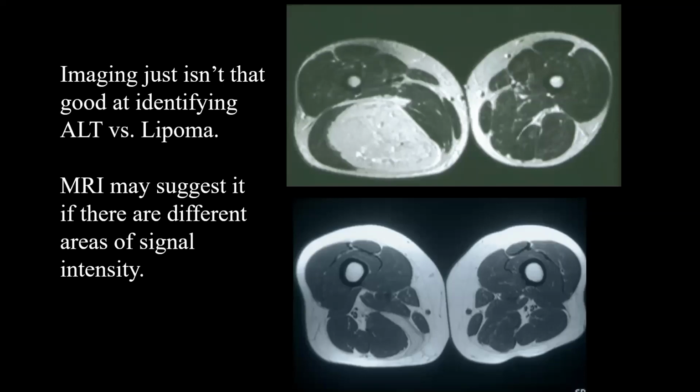Now, let's talk a little bit about the clinical imaging on this, which I will say that in some cases this has evolved. But in general, if anybody tells you they can reliably distinguish all cases of atypical lipomatous tumor from lipoma, I would say they're sadly mistaken. I mean, typically on MRIs like you see here, and these are two different patients with two right posterior thigh masses, typically you'll see a lesion that has similar signal intensity as that seen with normal subcutaneous fat.